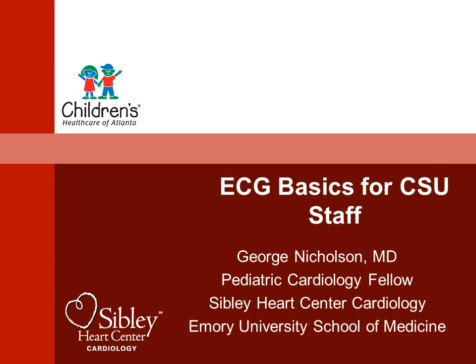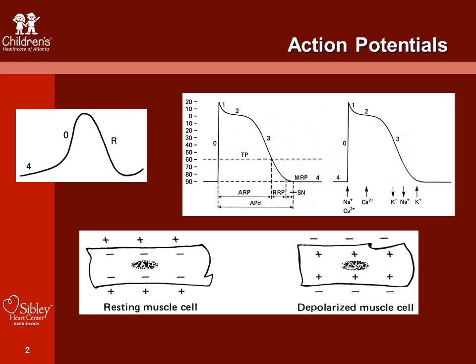I'm one of the cardiology fellows, and I would like to provide a basic overview of EKG information and parameters. I would like to draw your attention to the image in the upper right-hand corner on the screen, and we'll discuss the different phases of the cardiac action potential.